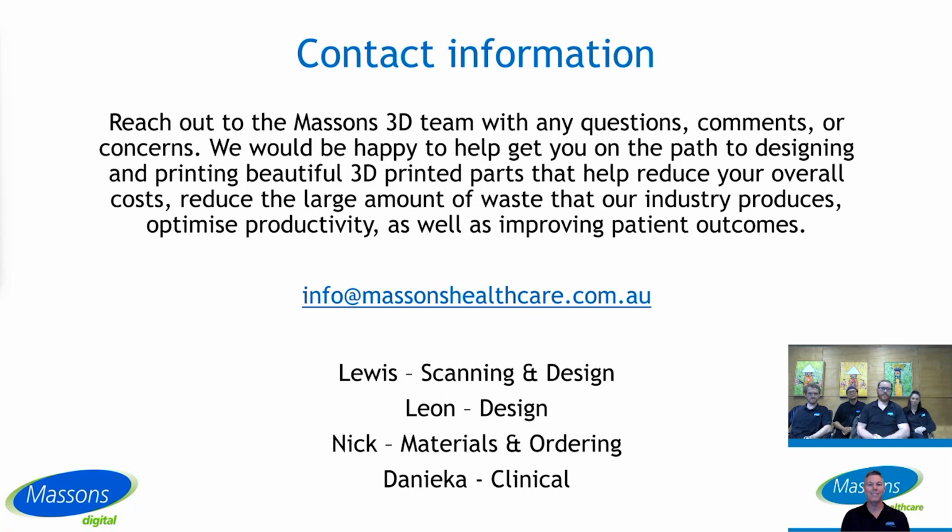Okay, thank you. The other option is also to scan the person lying prone, so that you have that full access. But yeah, the TechMed plates work as well.